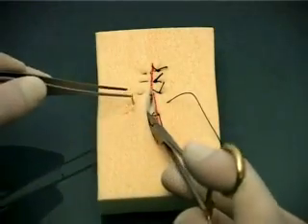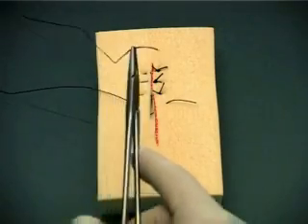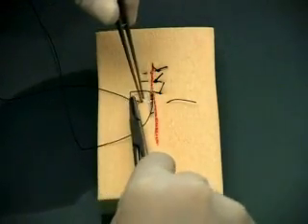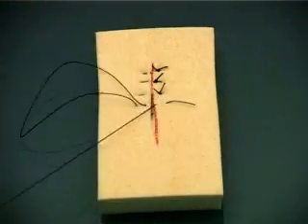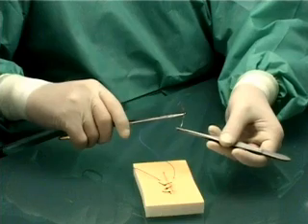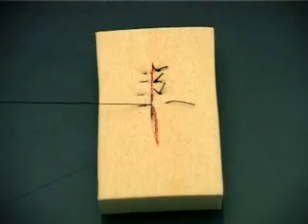Let's take a look again at the placement of the suture, paying close attention to how the needle direction is re-oriented using your forceps and needle holder, rather than handling the needle with your fingers. This involves a combined rotatory movement of both wrists. You are now ready to place the second set of sutures. You may find it more convenient to hold the needle holder in the palm grip fashion. The needle holder and forceps hold the needle; a combined rotatory movement of both wrists simultaneously re-orients the needle to face the opposite direction. In a wound where the edges are wider apart and deeper, the vertical mattress suture helps to evert the skin edges nicely.